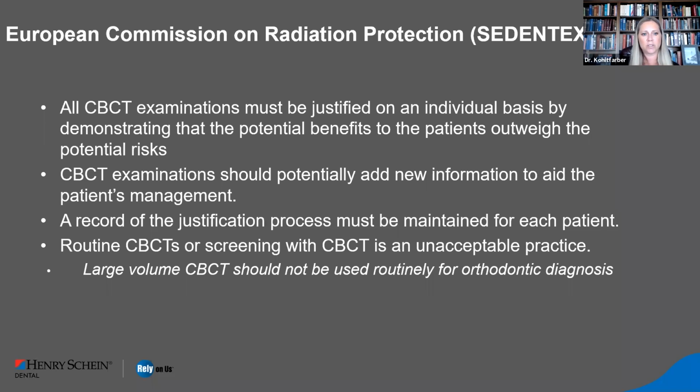So, wrap up with our summary, and this kind of reviews the recommendations as far as the SEDENTEXCT project. This is the European Commission on Radiation Protection. All CBCT examinations must be justified, and I think we showed lots of reasons that they could easily be justified, but they want them to be justified on an individual basis to try to make sure that the benefits are outweighing the risks for each patient.